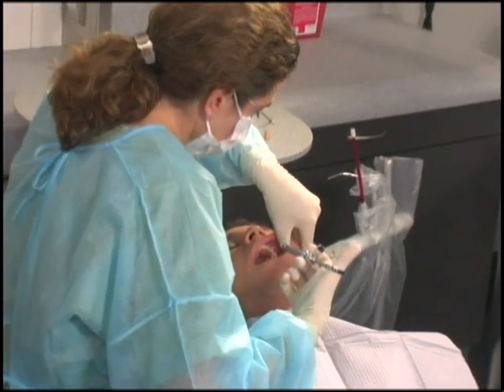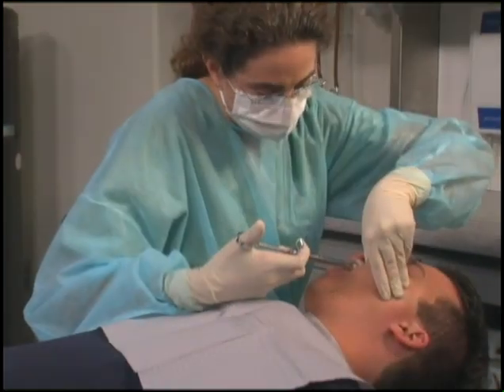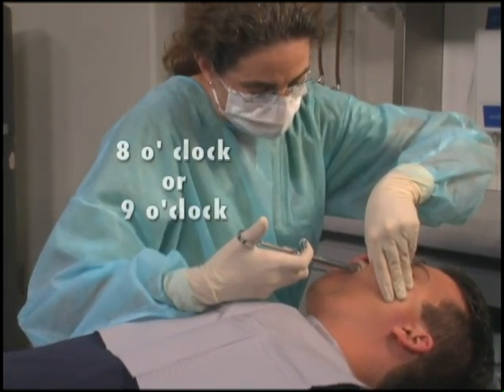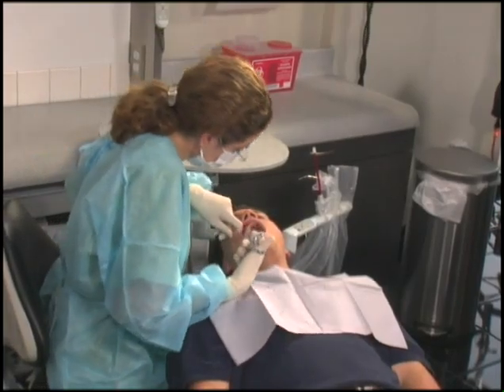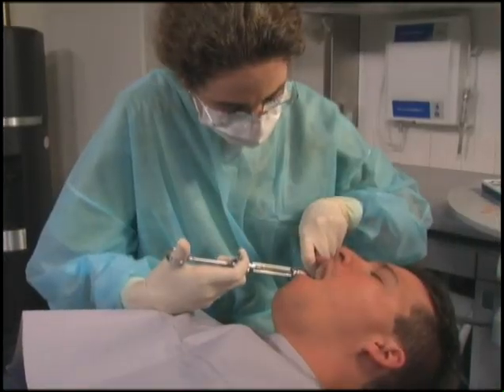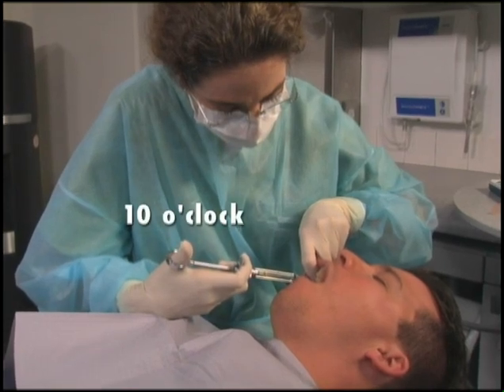For the left MSA nerve block, the right-handed operator should face the patient directly from the 8 or 9 o'clock position. For the right MSA nerve block, a right-handed operator should face the patient from the 10 o'clock position.